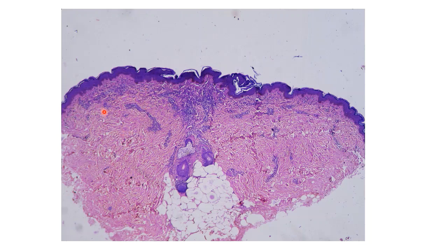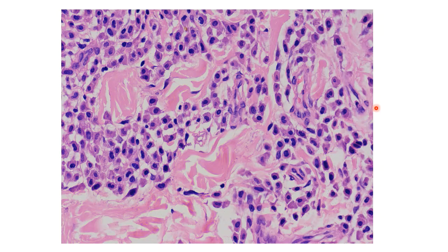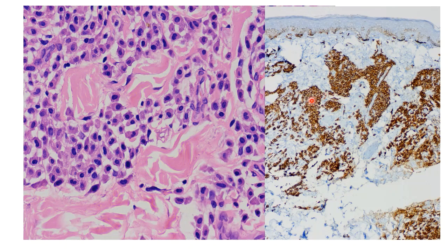For example, here we can see superficial perivascular inflammation. And on higher magnification, the inflammatory infiltrates of moderate intensity involving the upper and mid dermis. And the type of inflammatory cell is mast cell, which are highlighted by CD117 IHC. So it is a case of cutaneous mastocytosis.